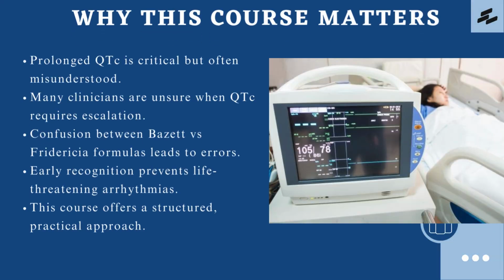Why this course matters. Recognizing prolonged QT in adolescents is clinically critical because misinterpretation can have life-threatening consequences. QT prolongation is a risk factor for torsade de pointes and sudden cardiac death. Yet, many nurses and junior doctors are uncertain when QTc should trigger escalation. Another source of confusion lies in the correction formulas, Bazett versus Fridericia, which often produce different values, especially in cases of tachycardia or bradycardia. Misapplication of these formulas can result in overestimation or underestimation of risk.